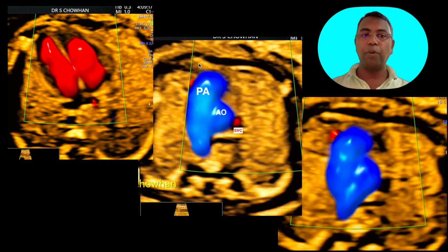This is the color flow. Here you can see the proper filling of the ventricles from the right atrium, from the atrium till the apex of the heart, and there is no flow, no bidirectional flow across the septum that should be seen.